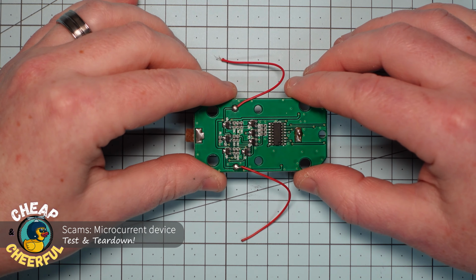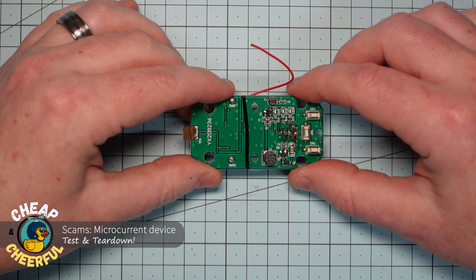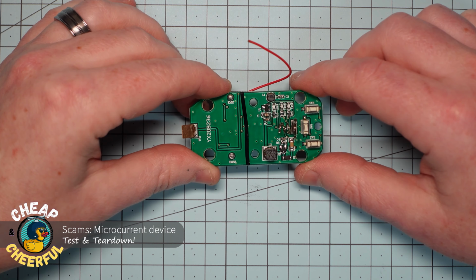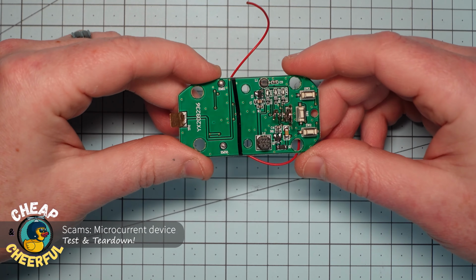Certainly not going to cause you to relax or fall asleep. It is very powerful. It will wake you up, but I'm not sure this is the kind of wake-up call that anybody wants at any time of the day, to be zapped with 80 volts. So yeah, I think that's how it works. Fairly simple.